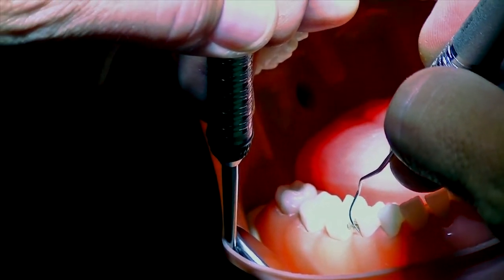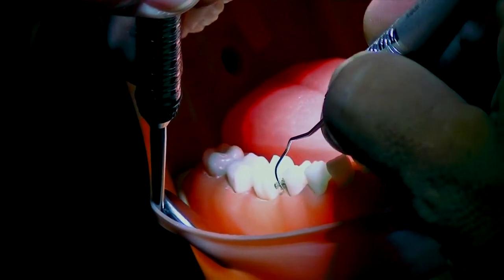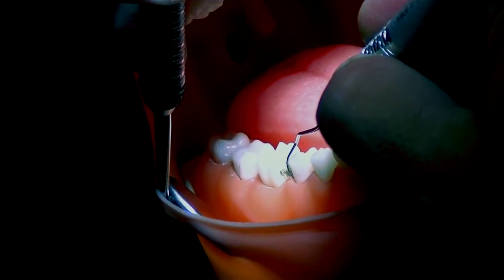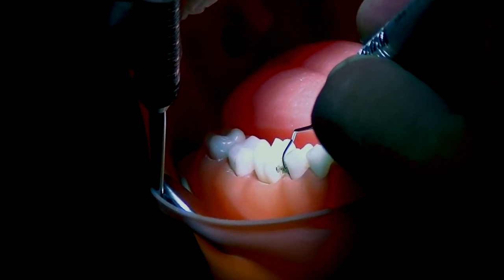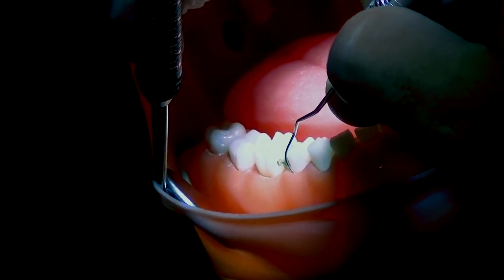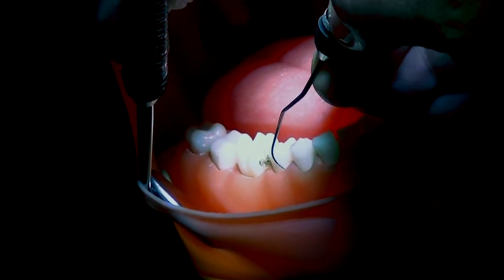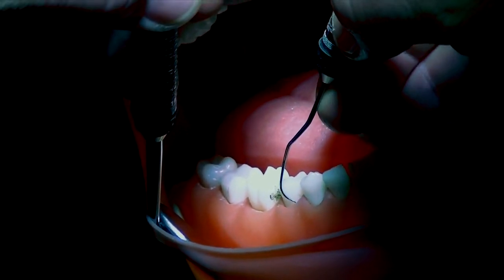Insert at the line angle. You might have to go a little bit of a diagonal so you can insert basically at the corner of the papilla, and then oblique strokes on the facial. Again, using wrist activation, we'll have to work on that on specific areas.